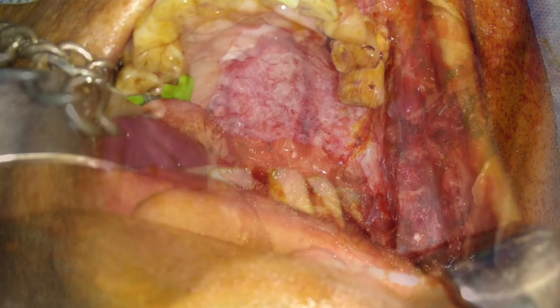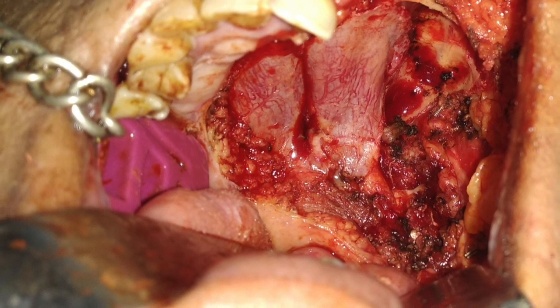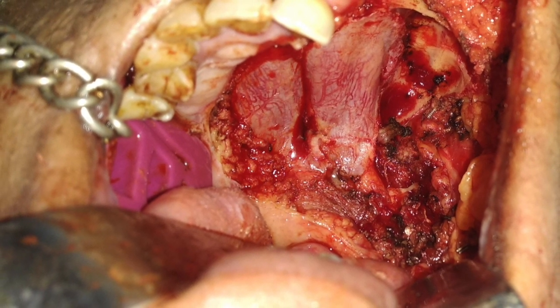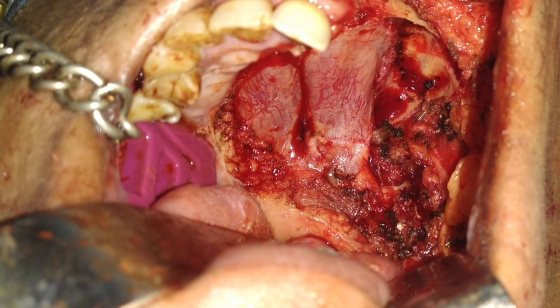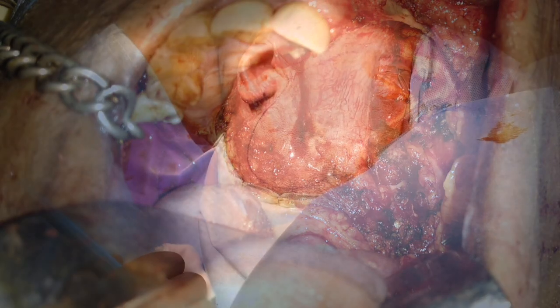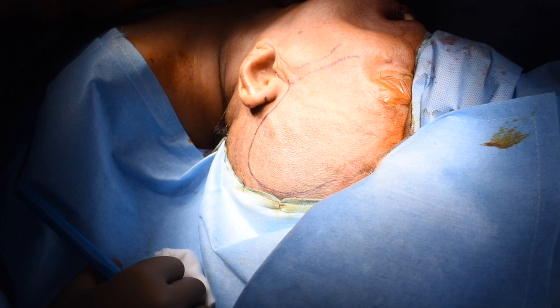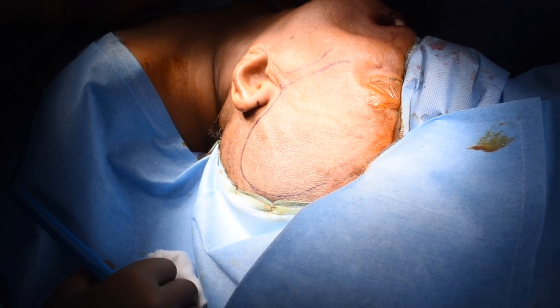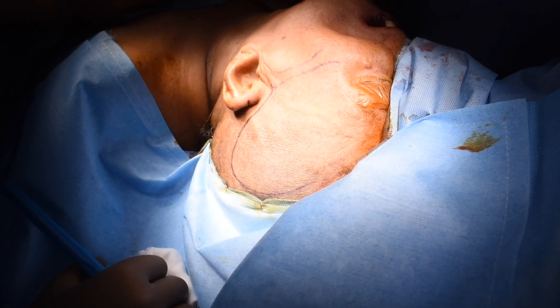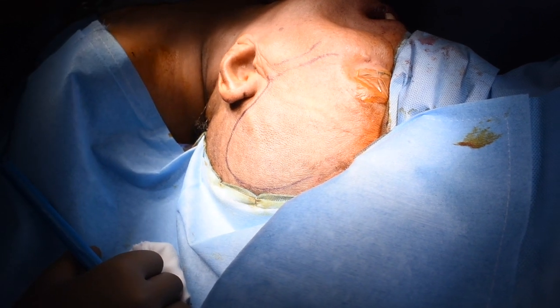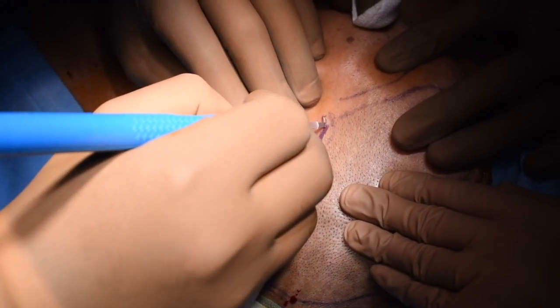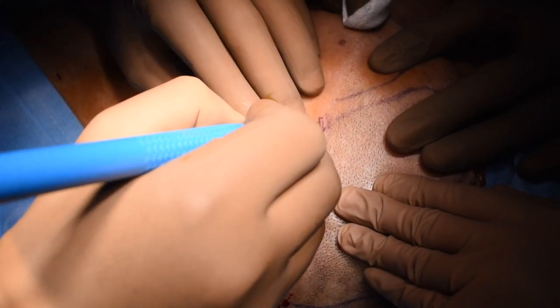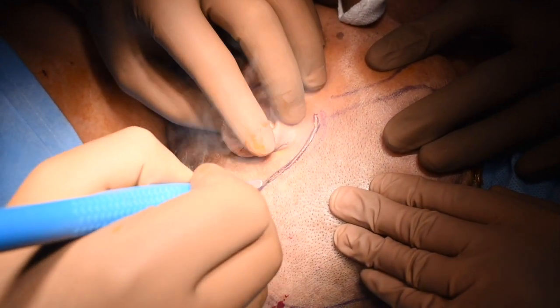She underwent a wide excision of the palatal lesion and inferior partial maxillectomy, and this is the defect after resection. The zygomatic arch is marked as a landmark. The approach is basically a pre-auricular incision with a temporal extension.